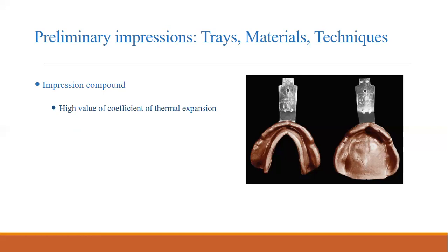لأنها ثيرموبلاستيك ماتيريال. فالأوتر سيرفيس عندنا بيكون cold، لكن الإنر سيرفيس بيكون لساته hot. فبهاي الحالة بصير عندنا internal stresses وبصير فيها distortion و poor thermal conductivity. أوكي، فهاي الأشياء بتأثر كثير على stability تبعت الماتيريال outside the patient mouth after we take the impression. So we have to pour this material as soon as possible.